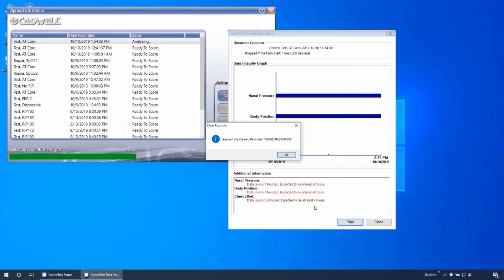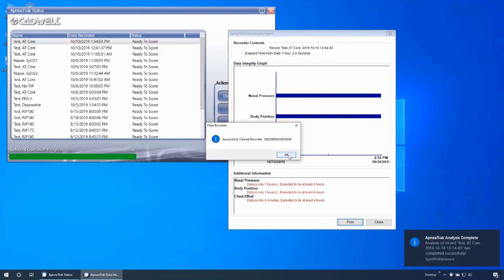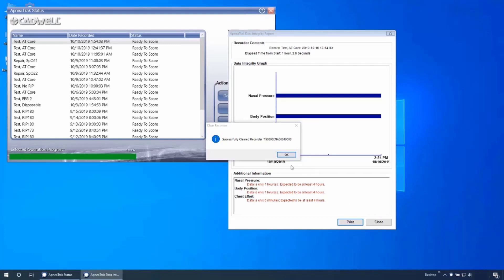After the data has been successfully downloaded from the device, the device will begin a full clear of the memory. Once it has been completed, you will receive a confirmation window.